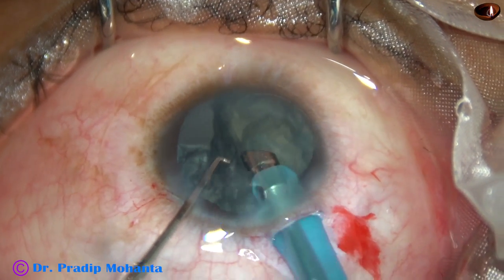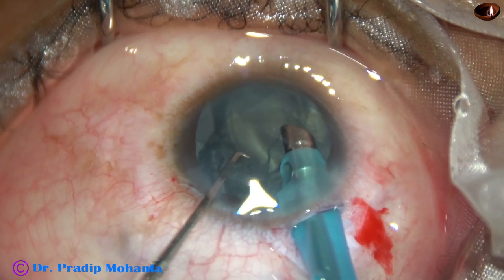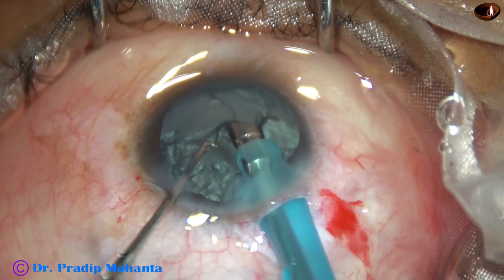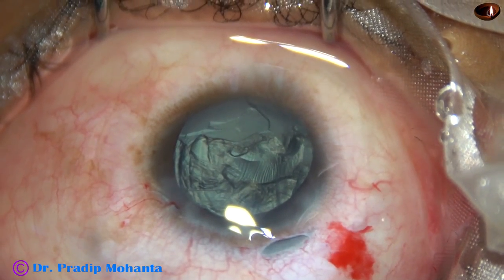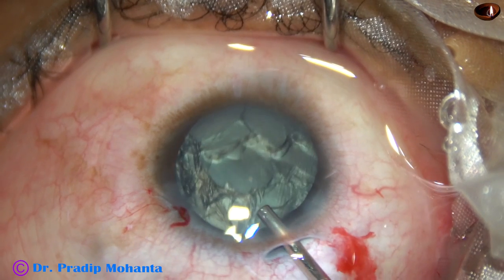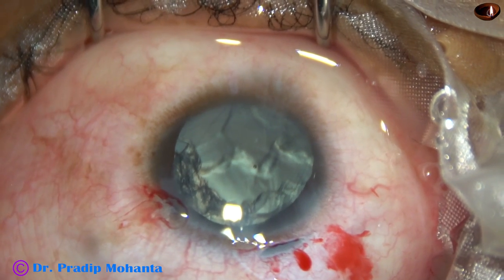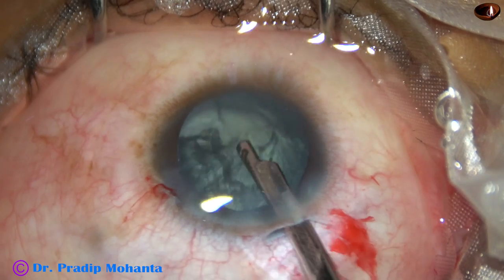Again, bevel sideways towards the right side. As I catch hold of some lens matter, I turn and make the bevel up. Most of the lens matter has been removed. Some epinucleus or cortical lens matter is remaining superiorly. I can remove this by a Simcoe cannula. I inject some visco, 2% HPMC. Since the HPMC will come out slowly, I will get some time to remove the cortical lens matter.